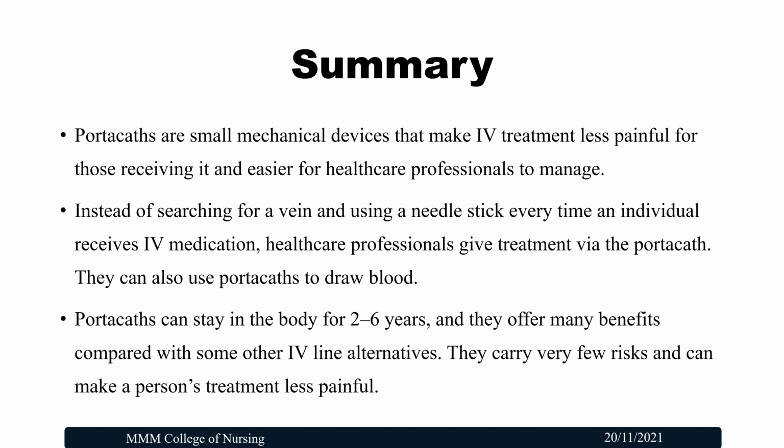Now let's see the summary. Portacaths are small mechanical devices that make IV treatment less painful for those receiving it and easier for healthcare professionals to manage. Instead of searching for a vein and using a needle stick every time an individual receives IV medication, healthcare professionals give treatment via the Portacath. They can also use Portacaths to draw blood. A Portacath can stay in the body for 2 to 6 years, and they offer many benefits compared with some other IV line alternatives. They carry very few risks and can make a person's treatment less painful.